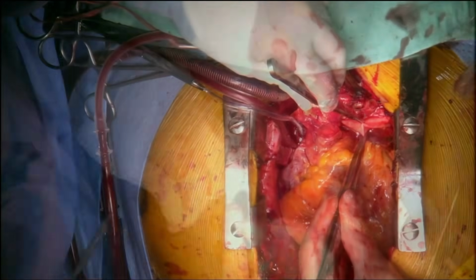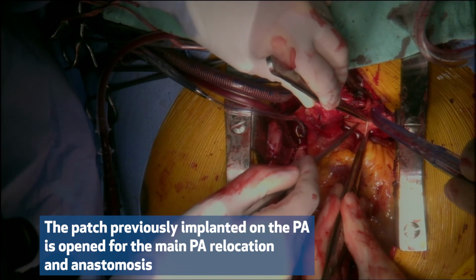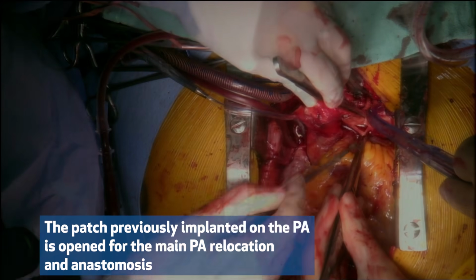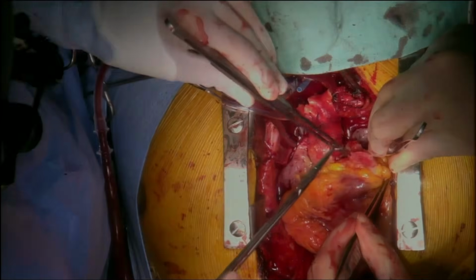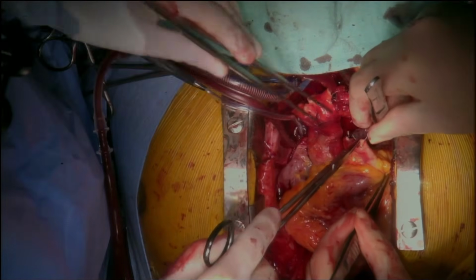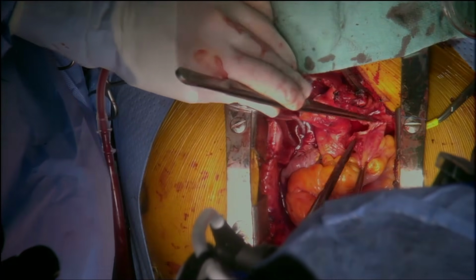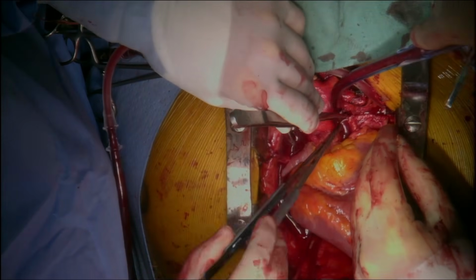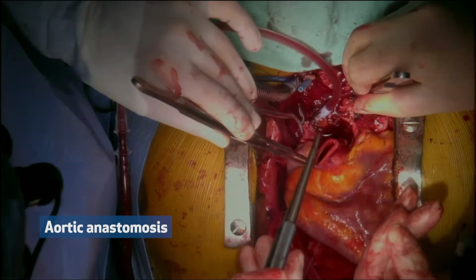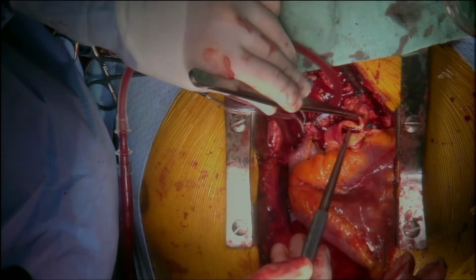The patch that was positioned on the pulmonary artery is opened to relocate the donor pulmonary artery, which obviously is on the left side compared to the aorta. The aorta is then anastomosed.